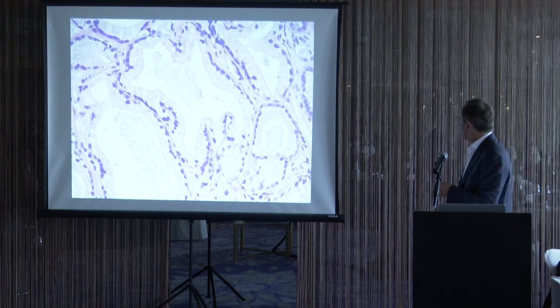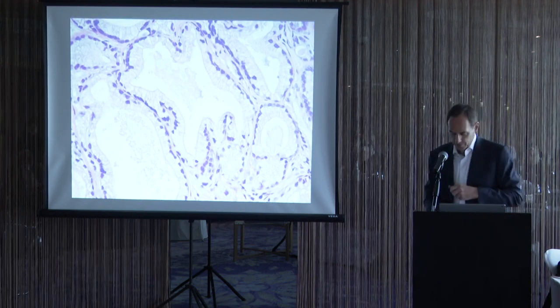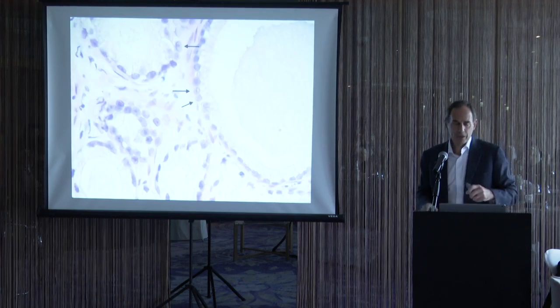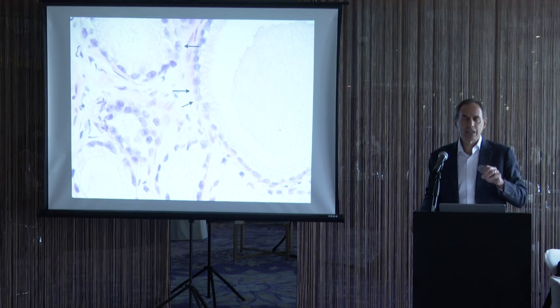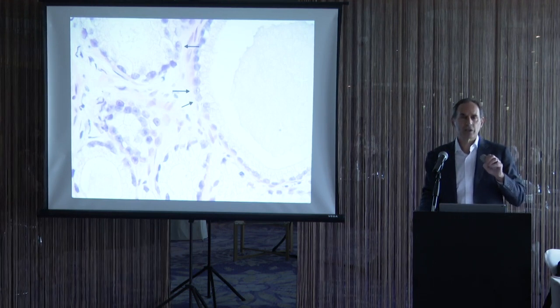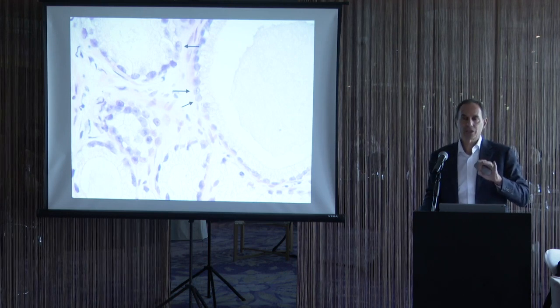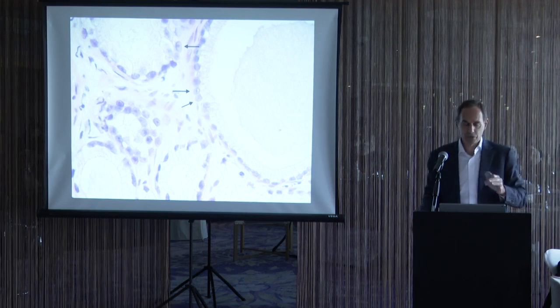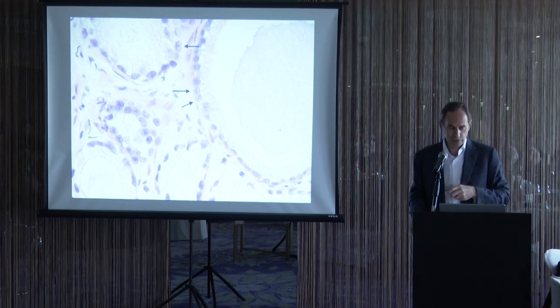But then we see some of these glands do have this infolding, which is more of a benign feature. So again, mixed features. And then we go to higher power. In order to diagnose pseudohyperplastic cancer, you need prominent cytologic atypia. You need to see prominent nucleoli, because architecturally, it has many benign features. You need the malignant cytology to establish a definitive diagnosis.